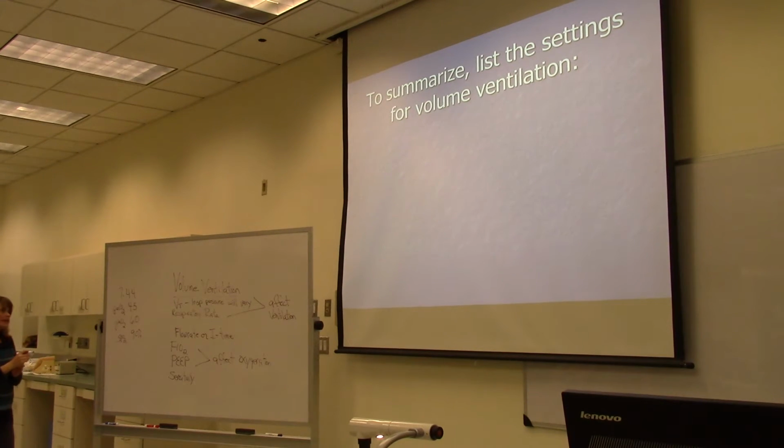All right, so here's the blood gas, and you need to make changes to get the blood gas into normal range. So what do you think of the pH? Is that in range? Yes. Okay, and what about CO2? Yes, so 35 to 45 is in range, and even though it's one away from not being in range, we're going to use black and white when deciding on what to do. So it's in range. PaO2 is 60 with a 90 sat.